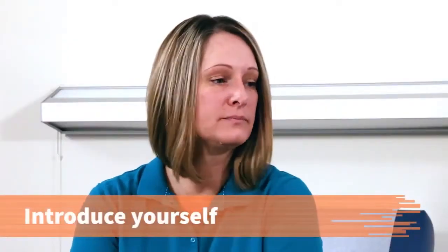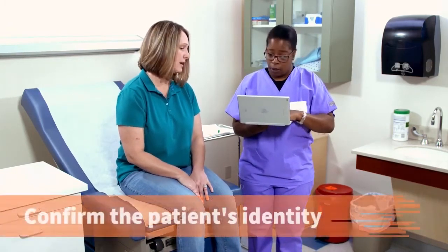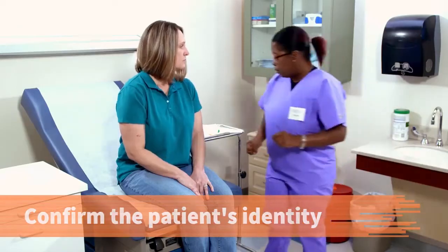Prior to entering the exam room, knock on the door and give it a moment. Greet the patient and identify yourself. Come in. Good morning, Tina. Good morning. How are you this morning? I'm good. How are you? I am good. My name is Tori. I am Dr. Shyman's medical assistant. I want to verify a few things with you. Okay. Can you give me your name and your date of birth? It's Tina Lakin, 4/21. Verify the patient's identity with her full name and date of birth. Make sure the patient's information matches the order and the record.